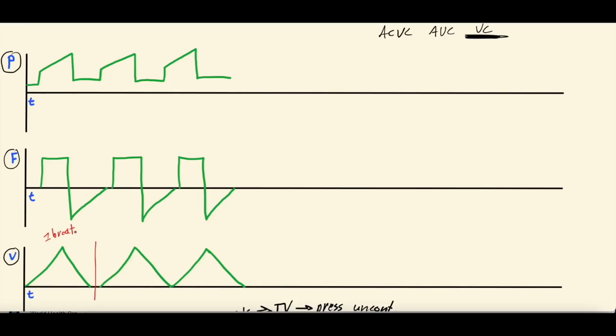And as you can see, the volume goes up for half the breath as the ventilator is delivering that breath, and then it goes down for the other half, right? That's as the patient is expiring. So this is inspiration, this is expiration. And this volume should be about what you set on the ventilator.